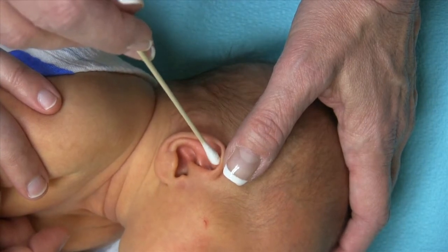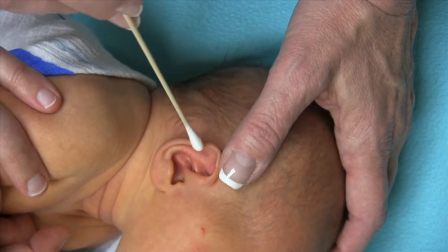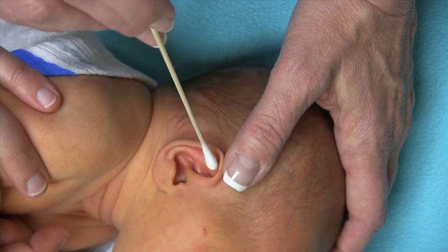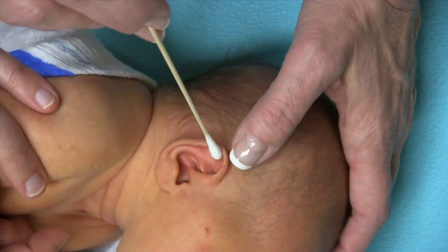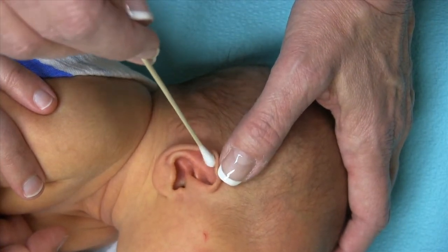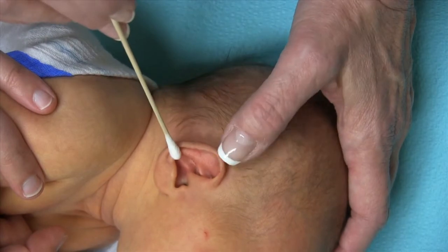If you do that, you're going to have some erosion here — you're going to have like a little pressure sore. So you want to use the tips and tricks that we showed you as far as trimming the back of that posterior former so that your retractor is positioned correctly and not on top of anything behind it.